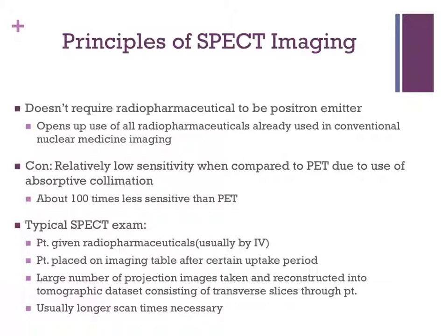In a typical SPECT acquisition, the patient is administered the radiopharmaceutical. Usually this is done by IV. And after an uptake period, sometimes as short as several minutes and as long as several days, the patient is then placed on the imaging table and moved in place for imaging.